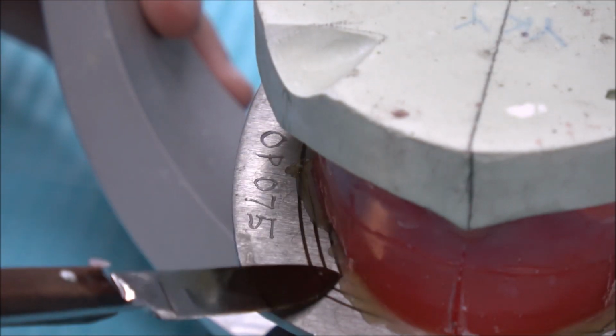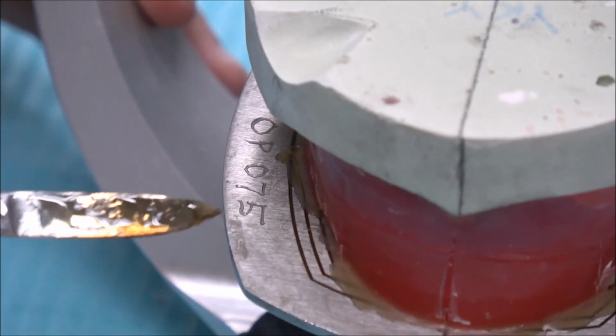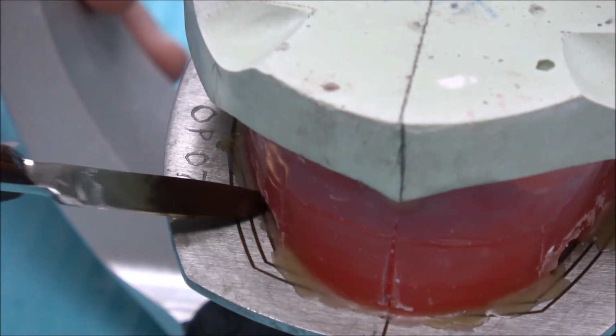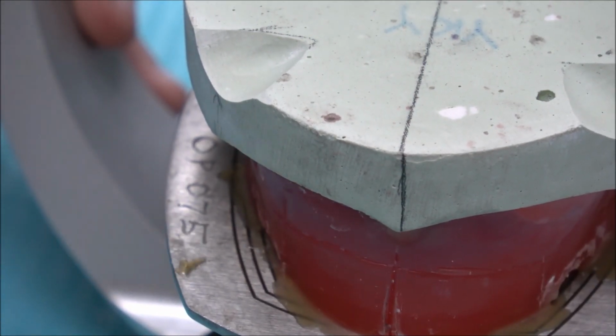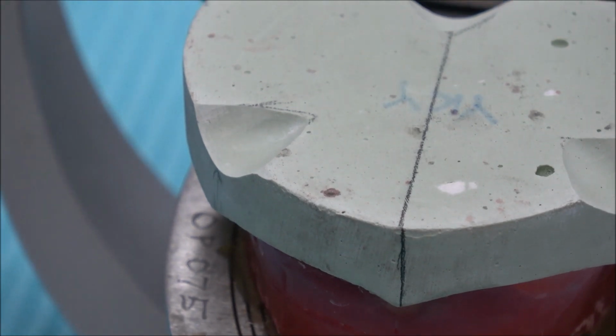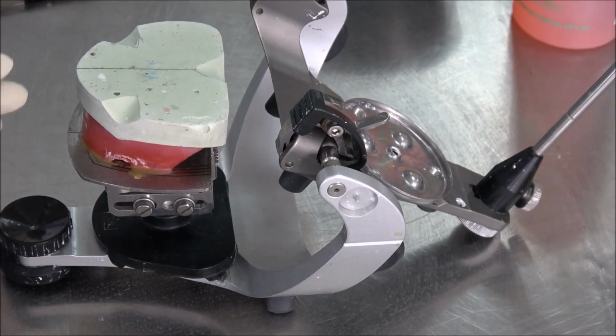We seal around the back, and there's one thing we have to pay attention to. Make sure you don't disturb or damage our notch here. Otherwise later we can't get back its position. Okay, now we are going to mount it.